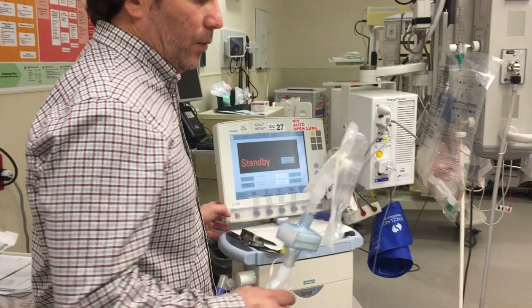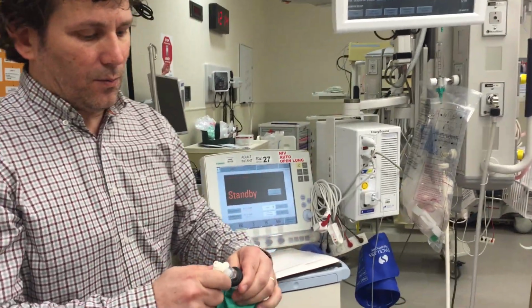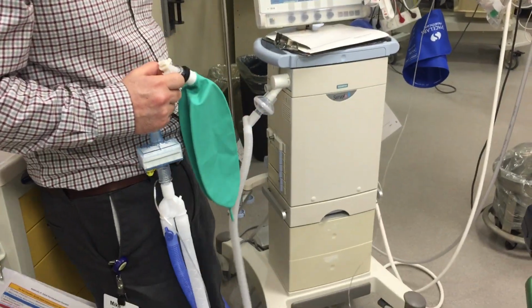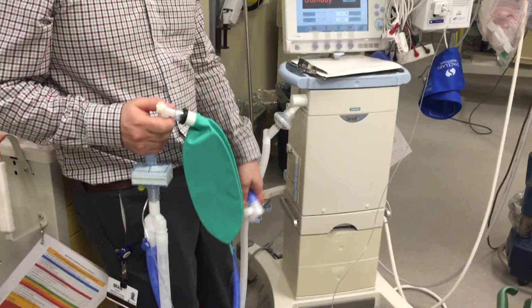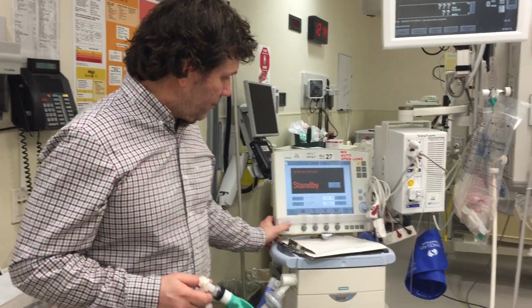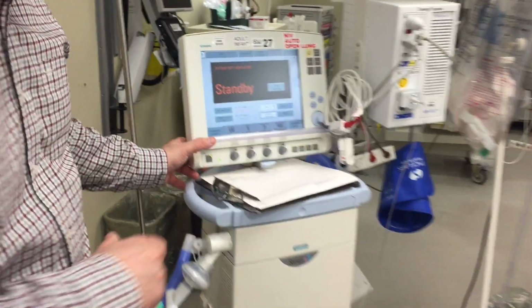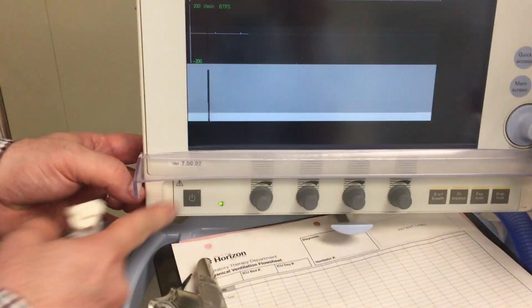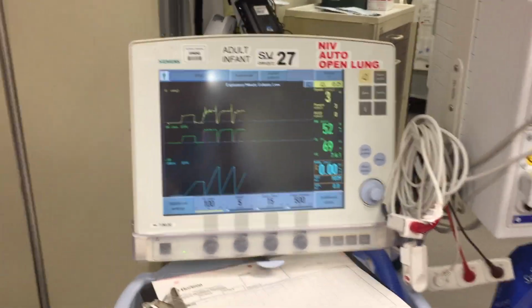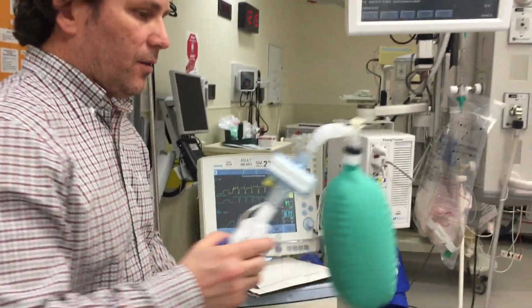So once we're happy with the settings and making sure everything's together, we want to make sure all our connections are tight. There's no leak. Sometimes you might see these things just hanging down. You want to make sure all those connections are on, nice and snug, and then you can hit the green button on the bottom, this one here, and that activates it. So I'm using a little test lung here. We're just going to put this on the bed.